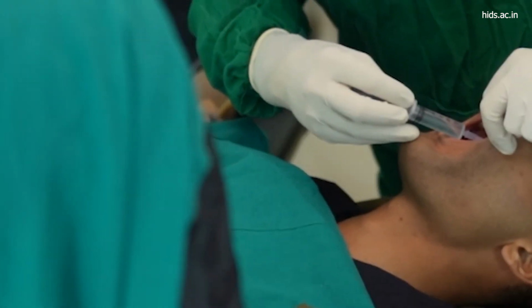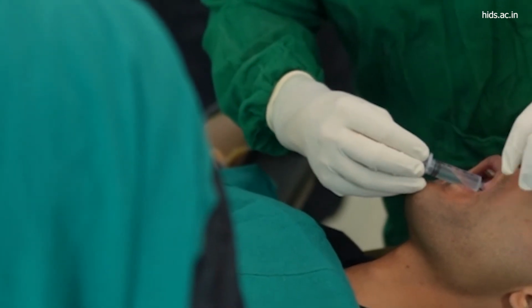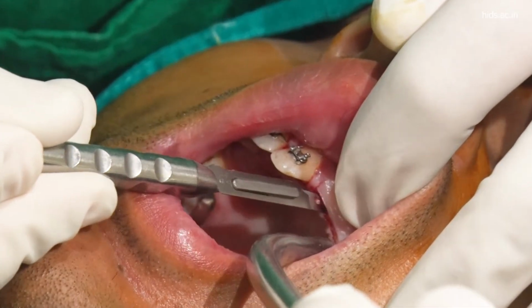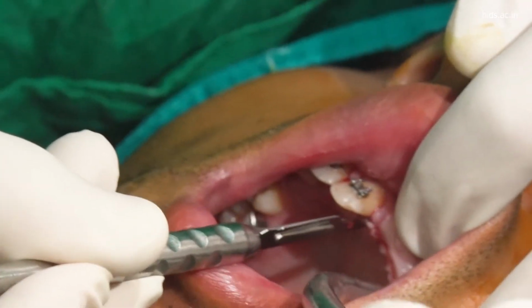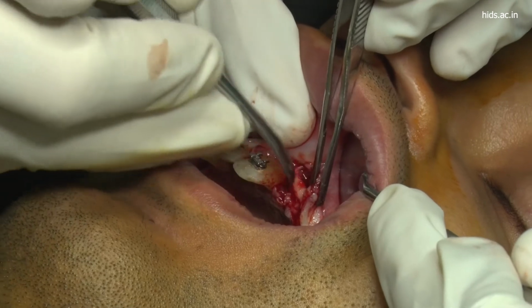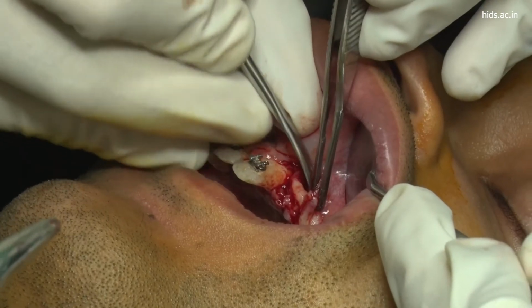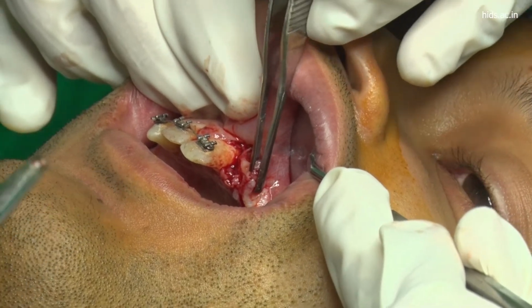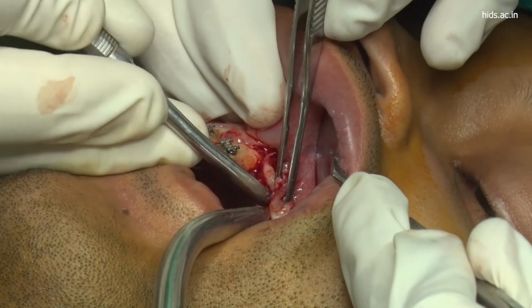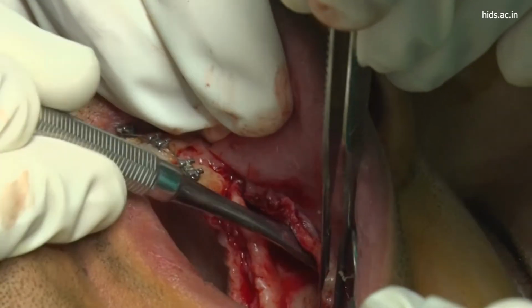Regarding the oral cavity, it has to be infiltrated with local anesthesia with adrenaline. We have placed a full thickness crestal incision with releasing limbs. The incision is sufficiently wide enough to accommodate the entire graft, and there should not be any chances of exposure after closure. The closure should be done very passively. That is how we have planned the incision. Reflection is done with a lot of care so that there is no laceration.